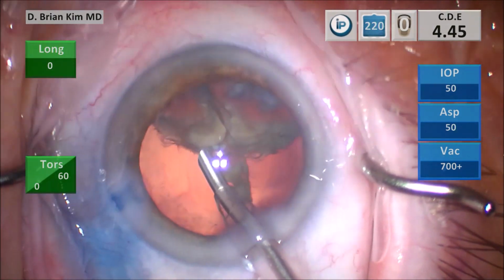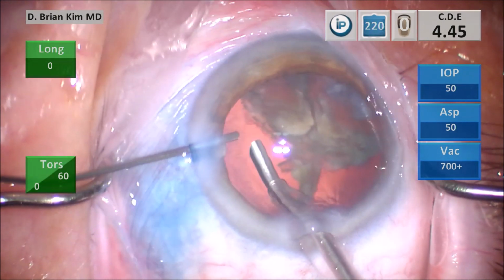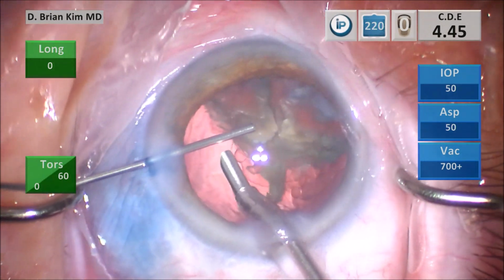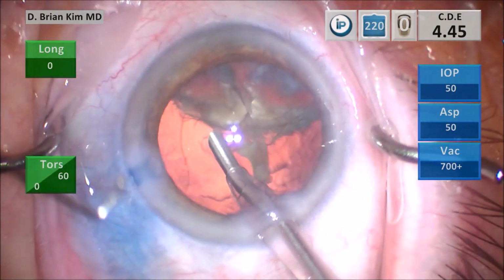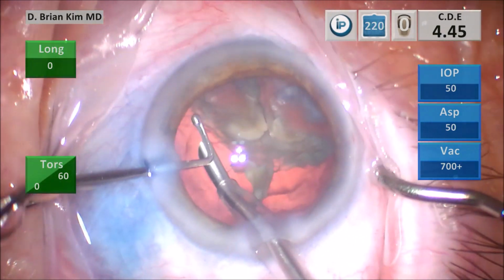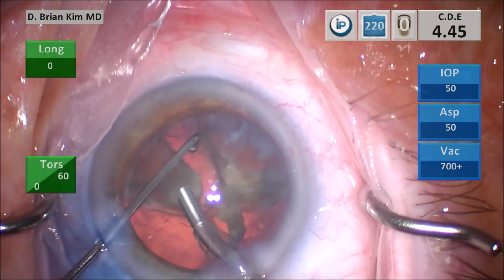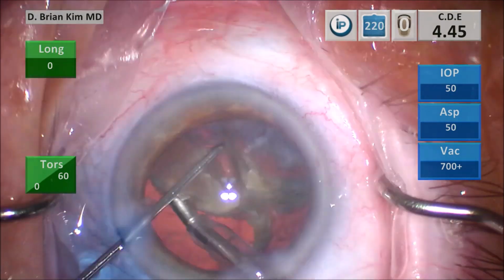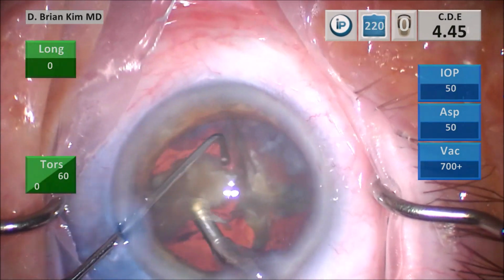At this point, I decided to add a little bit more viscoat to coat the corneal endothelium. With these really dense lenses, it really is important to protect the corneal endothelium. No matter how good your technique, when you have to use all that ultrasonic energy, you're bound to have some potential corneal trauma. So I position that piece between the chopper and the phaco tip, and I start to crush the lens piece.